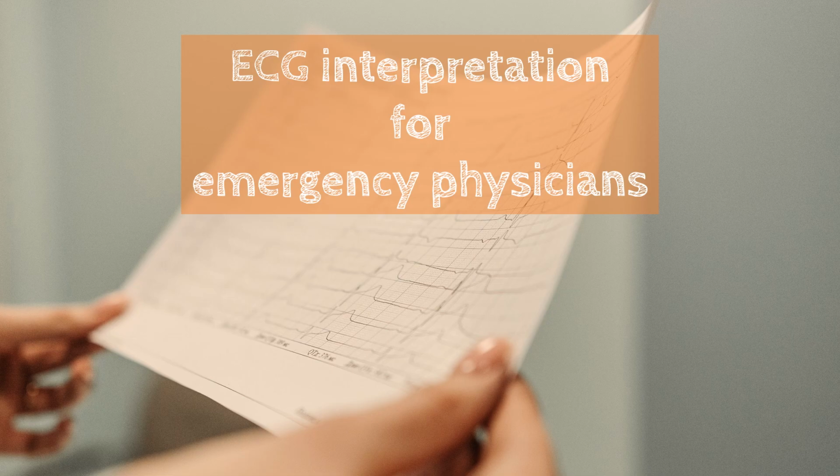Today I wanted to talk with you about ECG interpretation for the emergency physician. This is a lecture I've wanted to be doing for a long time. ECGs, I think all of us in emergency medicine think, are one of the most important bedside tests that we can do. It gives a lot of information. There's lots of diagnoses that can be made, but it's also really, really hard.